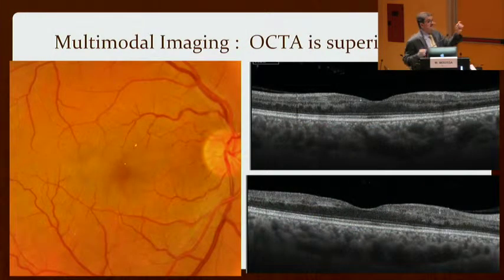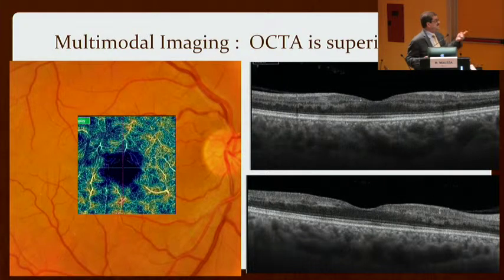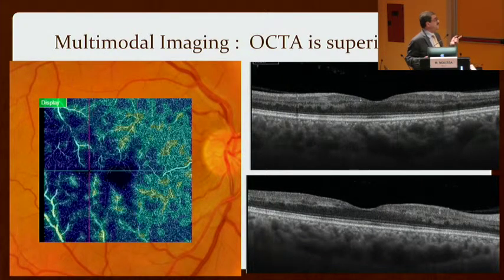Look at this. There are very tiny cholesterol emboli around the fovea. When I magnify the picture, look, is this the cause? It probably is the cause, but sometimes we see this and we see normal fluorescein angiography and we cannot explain why this is going on because it hits only the deep capillary plexus. And here is the overlying flow. You can see the ischemia, and we can see much more ischemia if we go wider and wider.